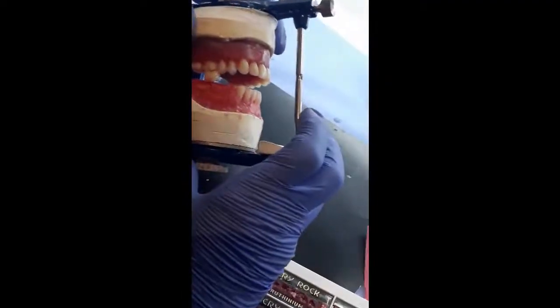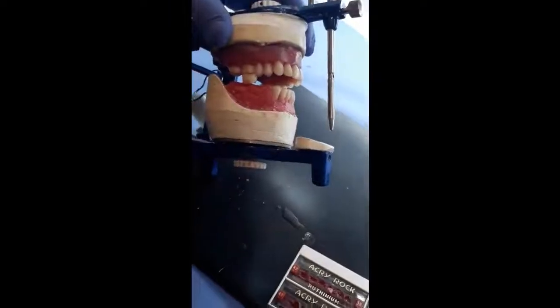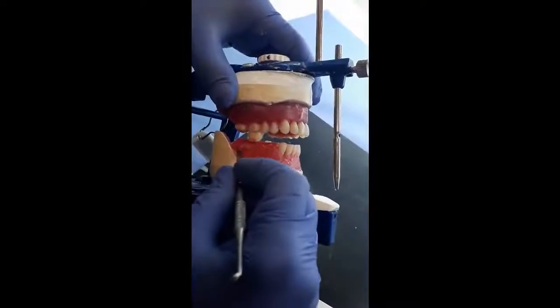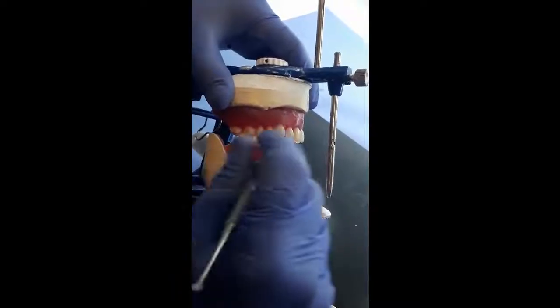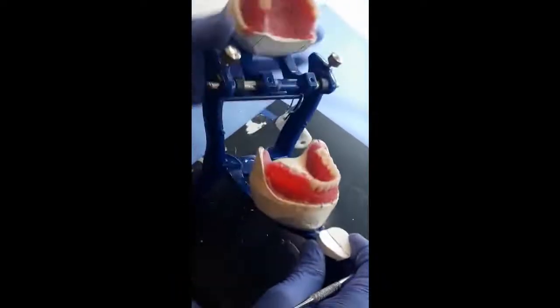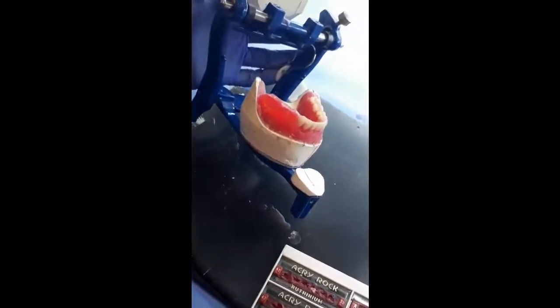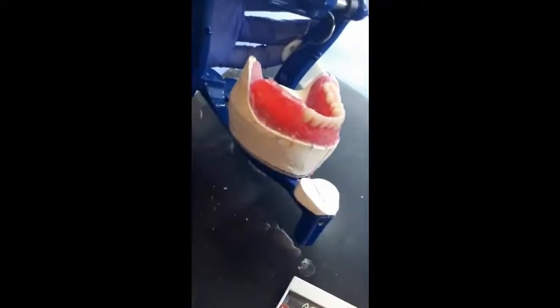buccal groove. Now we close the articulator and we mark the area in an arch form, because the articulator closes in arch direction. Now remove the wax in the area.